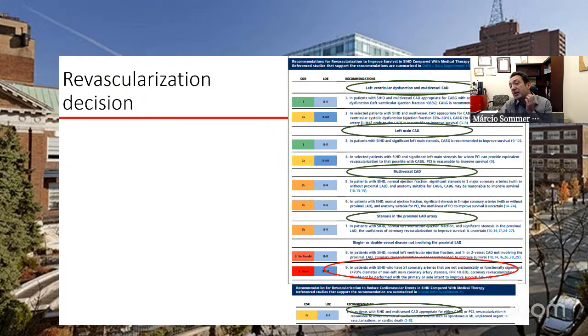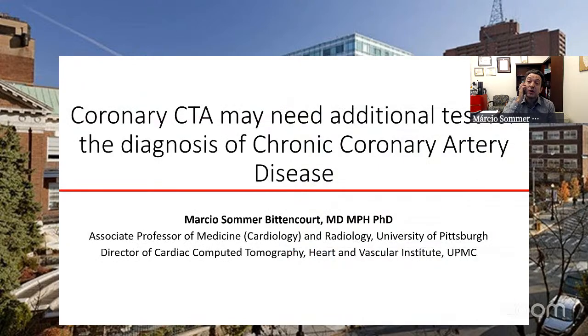You might say you need the invasive angiography to confirm the CT. So maybe after the CT, you see that. But if the CT doesn't see this, why would you need to consider revascularization? You don't even need, if you look at this really well, same thing for FFR CT that we do a lot. The data here says essentially that anatomical information guides revascularization. So I'll just say that maybe we can do everything with CT.